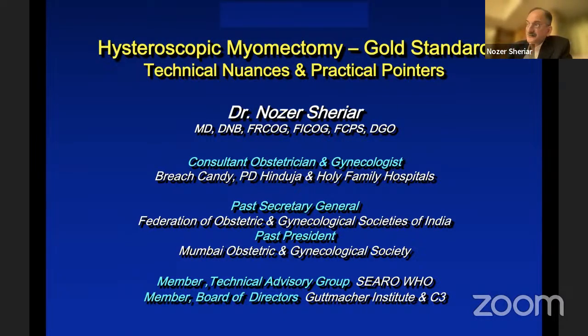Of course, I must confess that we were doing second look scopies, and I do not believe I need to do a diagnostic hysteroscopy anymore. When you've got imaging, when you've got 3D ultrasound, I do not do diagnostic hysteroscopies. For me, hysteroscopy is when I need to correct something. And today I talk to you about the technical nuances and practical pointers.